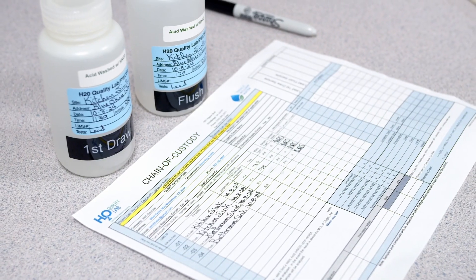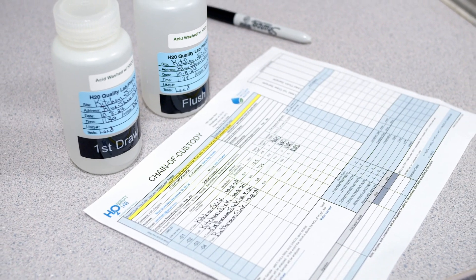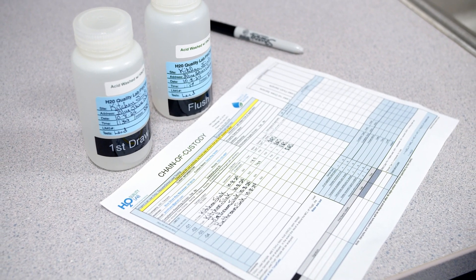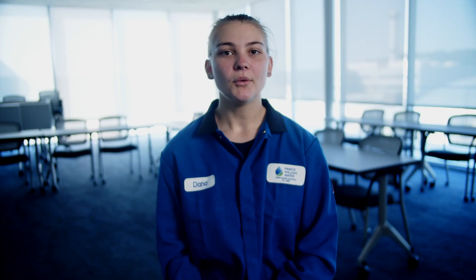Return the samples with the chain of custody to the laboratory for analysis. You will receive the results from the laboratory via email, so please ensure your contact information is written clearly on the chain of custody.